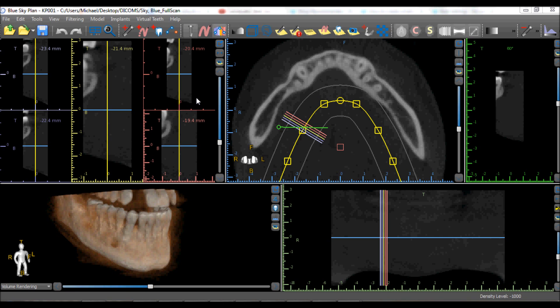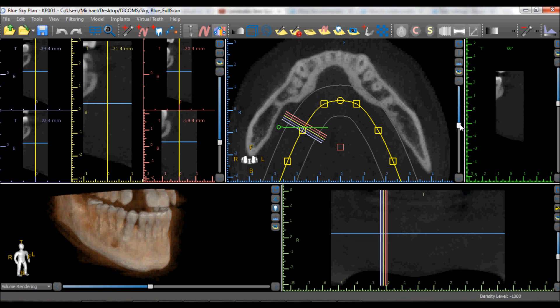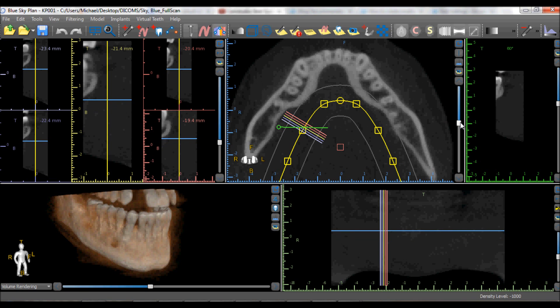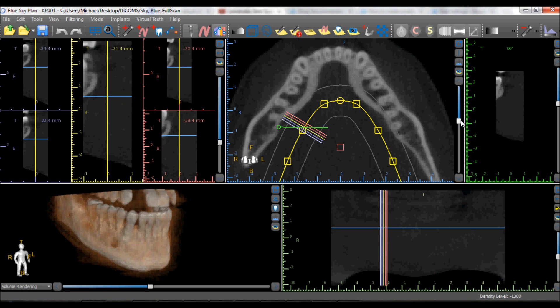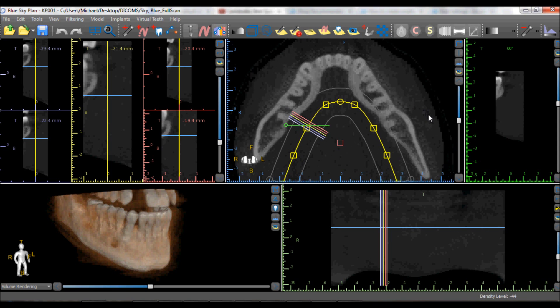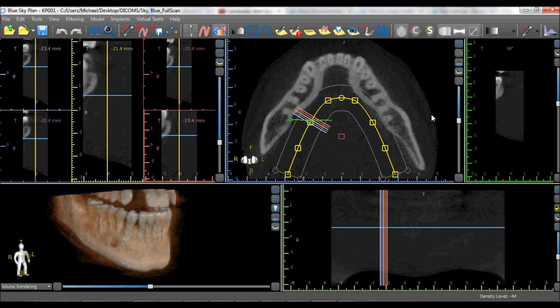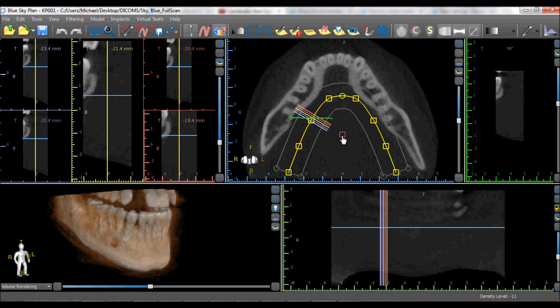After loading a new DICOM set for the first time, the panoramic curve should be aligned to go through the middle of the ridge of the patient. An axial slice should be identified by using the slider to the right of the axial view that shows as much of the patient's ridge as possible. Once that slice is identified, the panoramic curve should be aligned to go through the middle of the ridge.